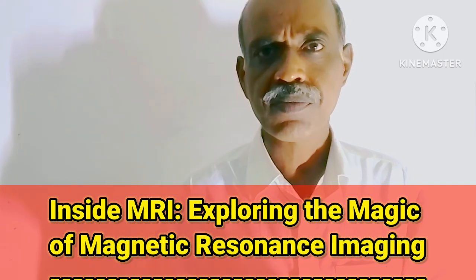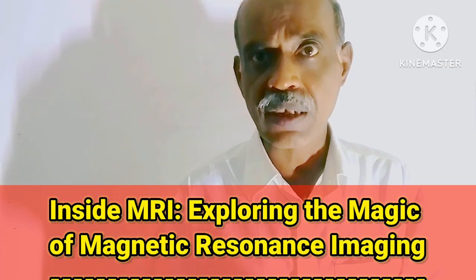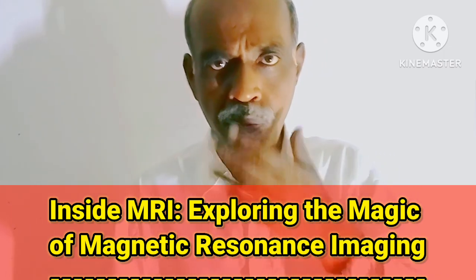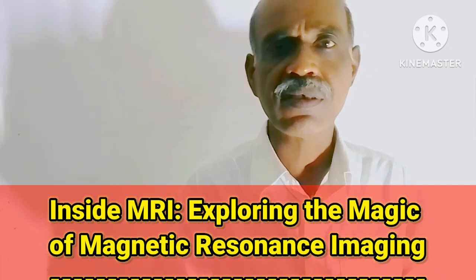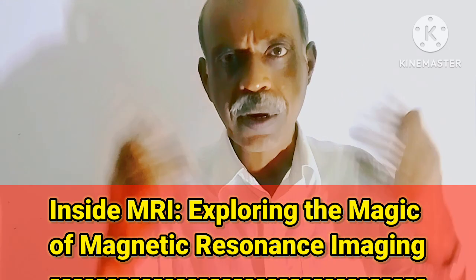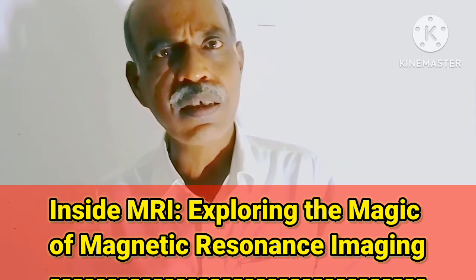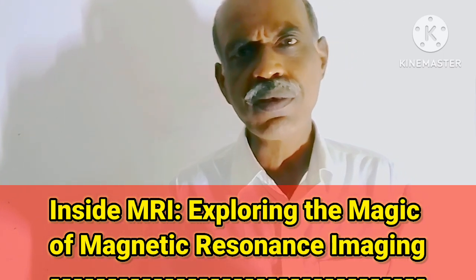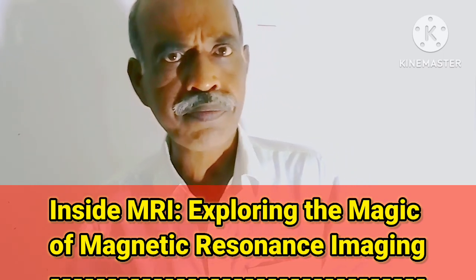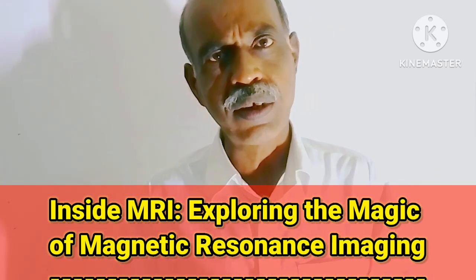Anyway, this is a common imaging technology nowadays for capturing images of the bones, joints, muscles, liver, kidney, brain, tumors, and cancers. For various diseases and various problems, MRI imaging technology is used nowadays.